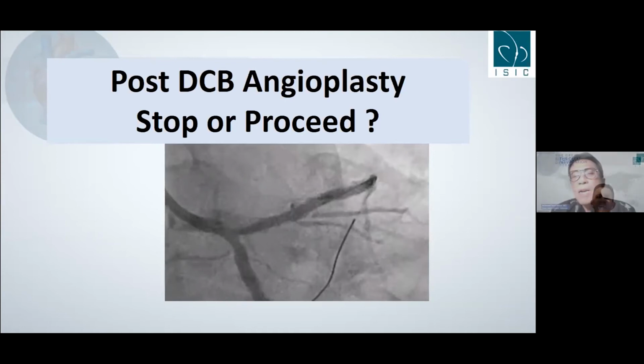Thank you. I have to say again, this is from my personal perspective. I believe this strategy did not remove the floating struts from the left main. So the mechanistic problem which created the first instance of restenosis still exists. So I would definitely not stop at this point. I think this needs to be fixed, and there are two options.